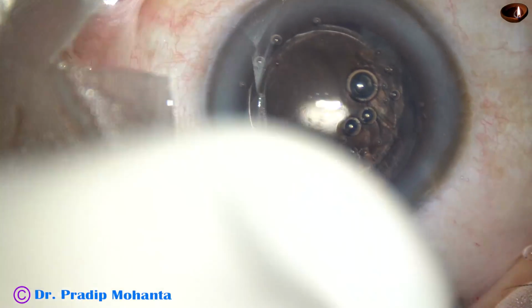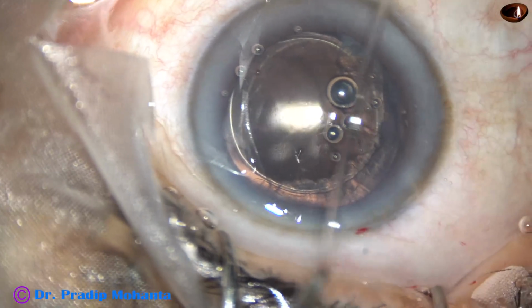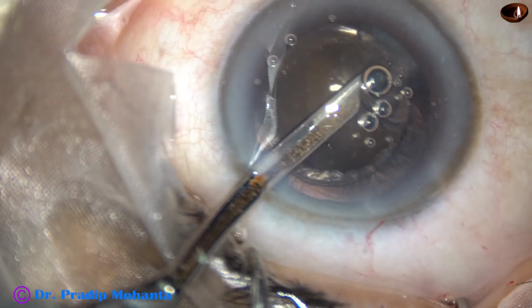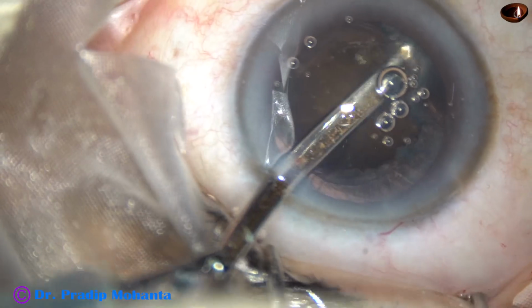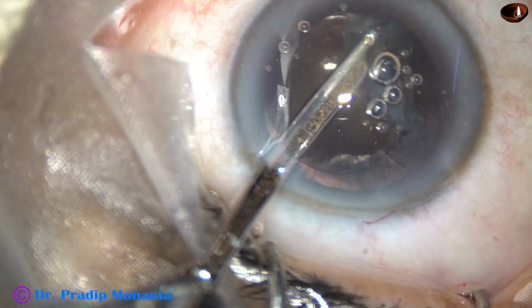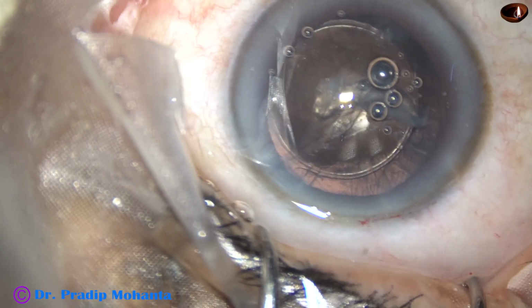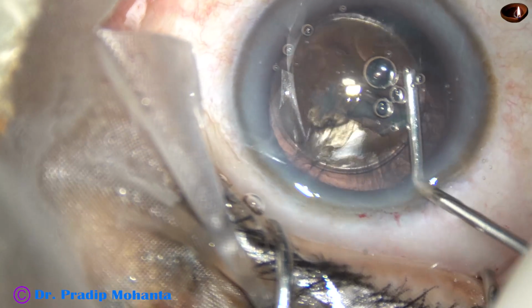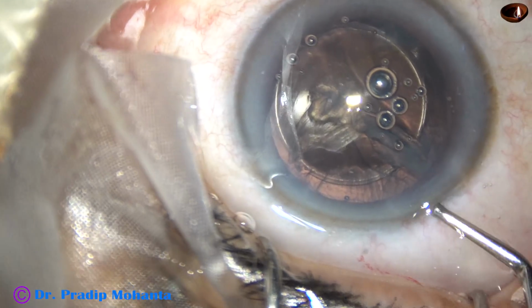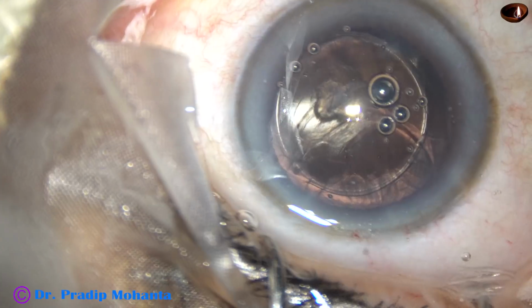This is viscoat again, and now my plan is dry aspiration of this cortex. I don't want to use a lot of fluid. I don't want to hydrate the vitreous, though viscoat is acting as a barrier, and it will act as a nice barrier. It will not allow the BSS to go and mix with the vitreous.